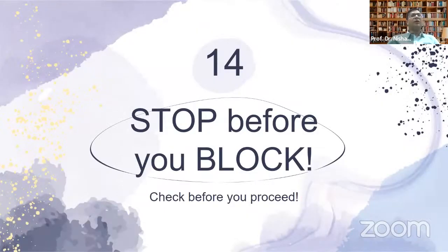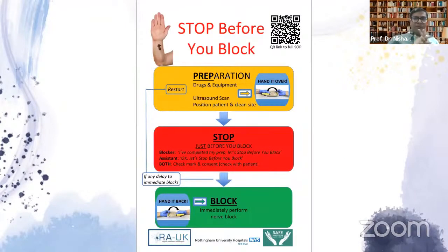And always remember, complications can occur anytime. So you have to stop before you block, or you should check before you proceed for a block. Now, there are certain preparations that you have to do. Stop before you block. So you prepare your drugs and equipment. You do a scan first. You position the patient and clean the site. And just before you're introducing your needle, you stop and you say that I've completed my prep.